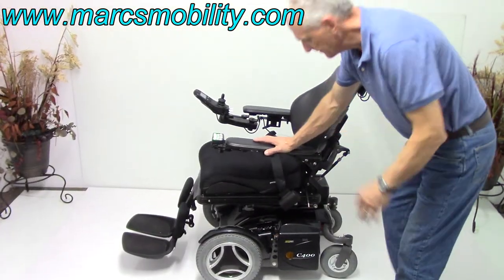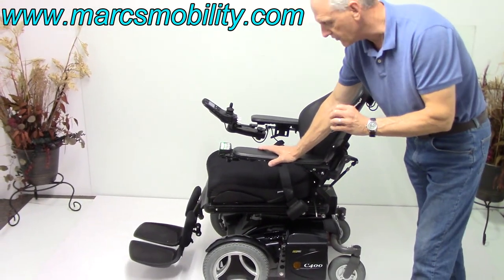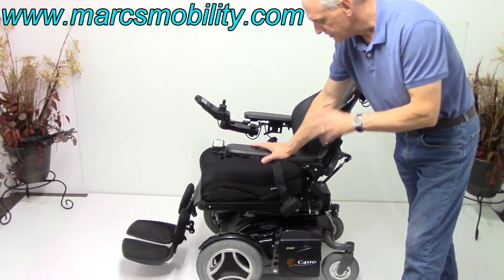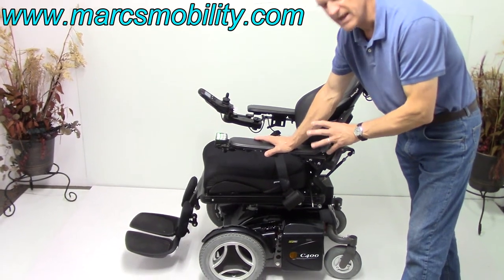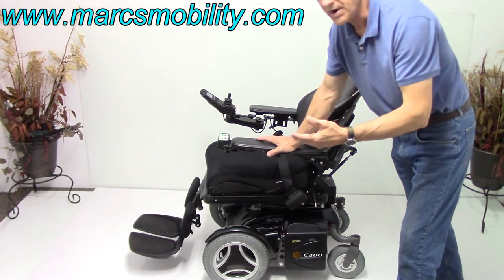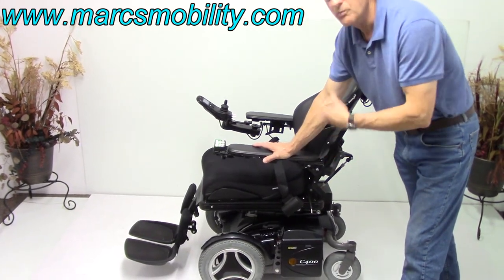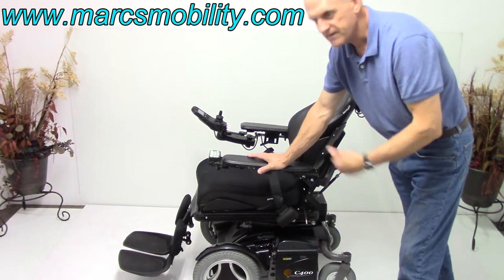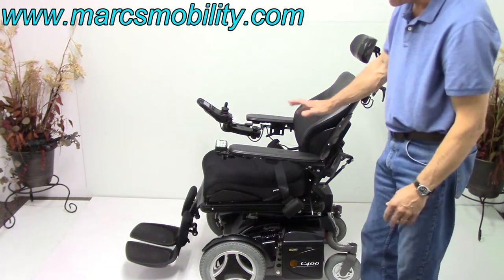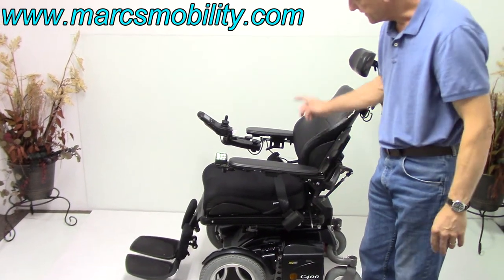There are batteries on both sides. What I did not mention is this chair will take 75 amp batteries. So if you're looking for a chair with long battery range, this chair will take the largest batteries you can put in a Permobil — 75 amps — which will give you 15 miles plus easily, maybe 20, but the manual states 15. With 75 amp batteries, this chair for its size will give you more distance than a C300 or a C500, because the C500 is heavier even though it takes the same batteries. This chair weighs a little less than 400 pounds. It takes two 75-amp batteries, one on each side.